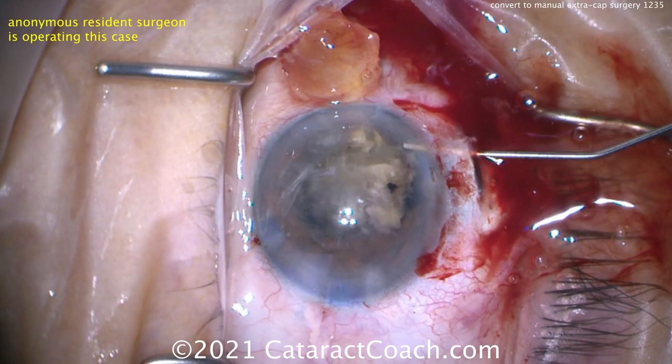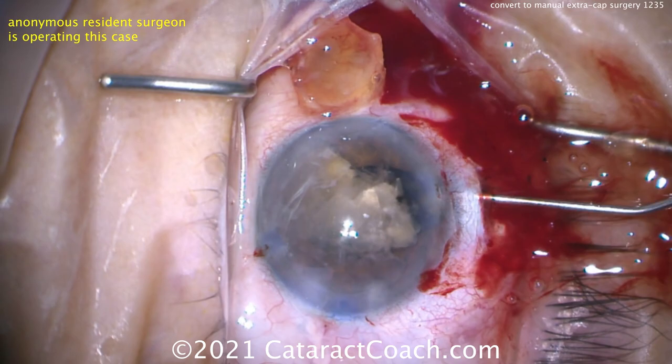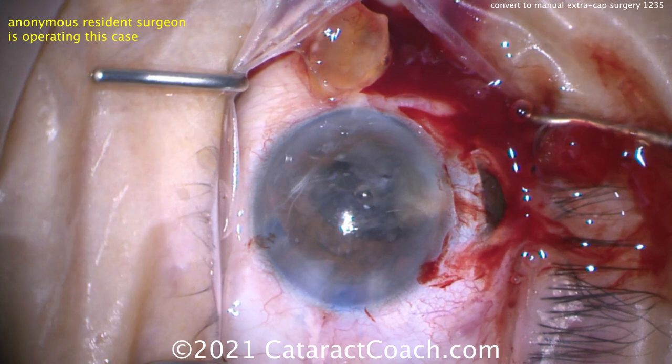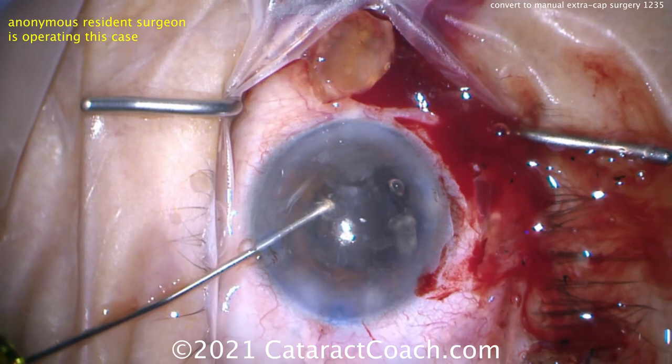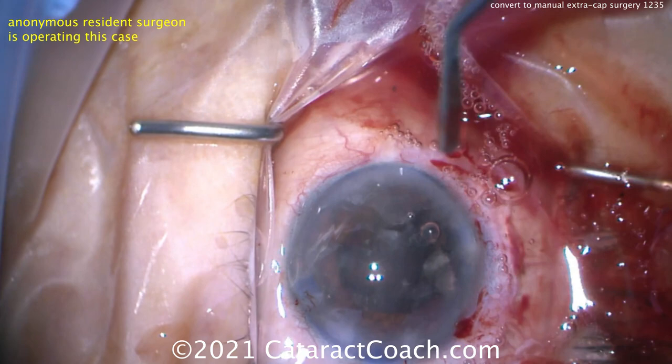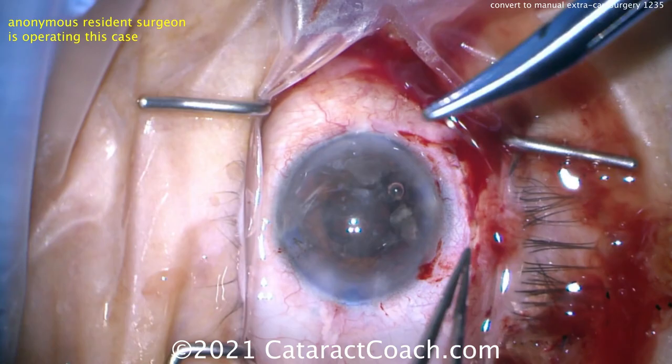There's a little bit left. Here's the last half of the lens nucleus. Being very careful not to damage the iris. We've got a little bit of iris prolapse. There's the rest coming out. Now the nucleus has been fully removed. Put some viscoelastic, push the iris back in the eye. With the eye full of viscoelastic it'll be much easier. We can go ahead and suture up that main incision.